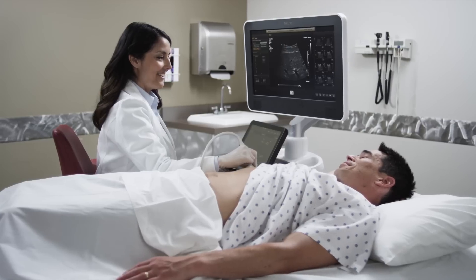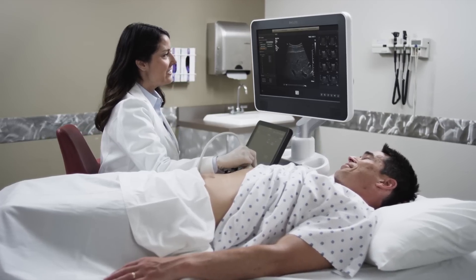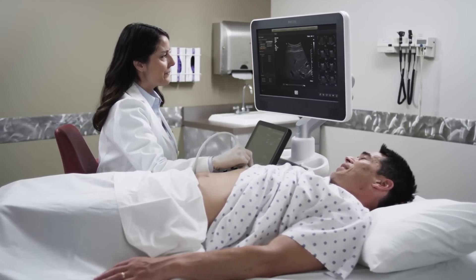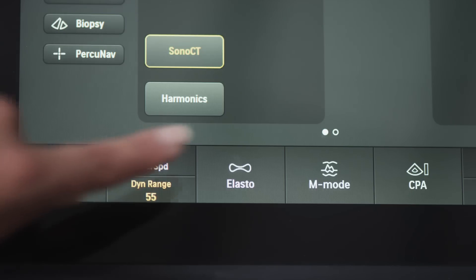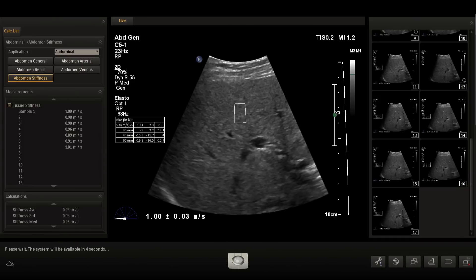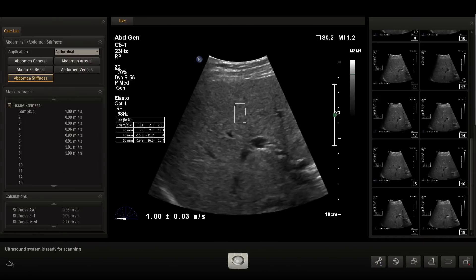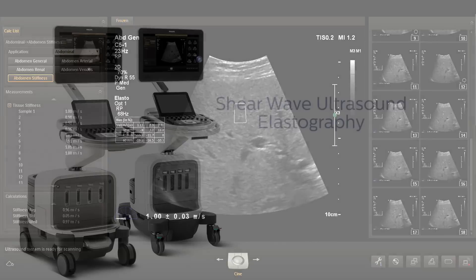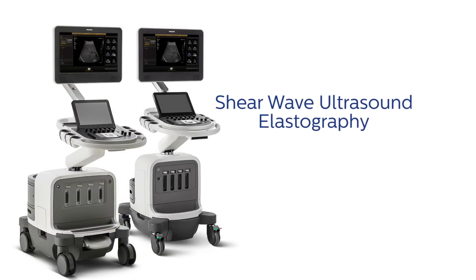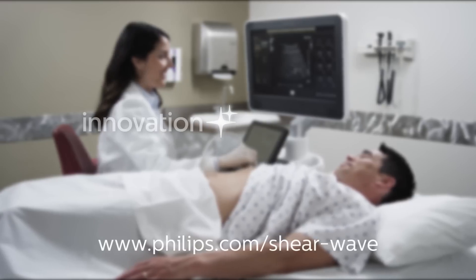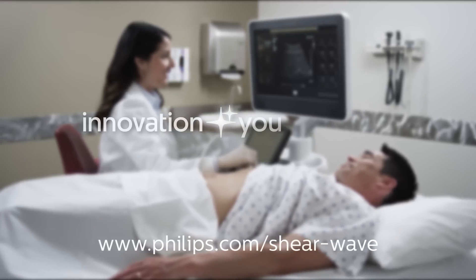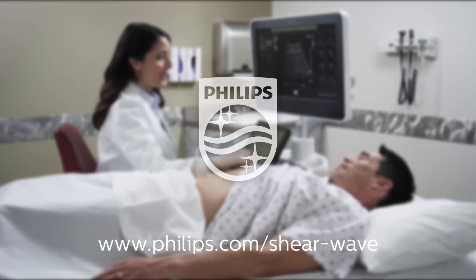Now ultrasound labs can expand their services to offer the next step in liver fibrosis and cirrhosis screening — a step that offers a less invasive, simpler way to reach a definitive diagnosis. ShearWave Elastography: Liver Assessment Made Easy. Innovation and You. Philips.